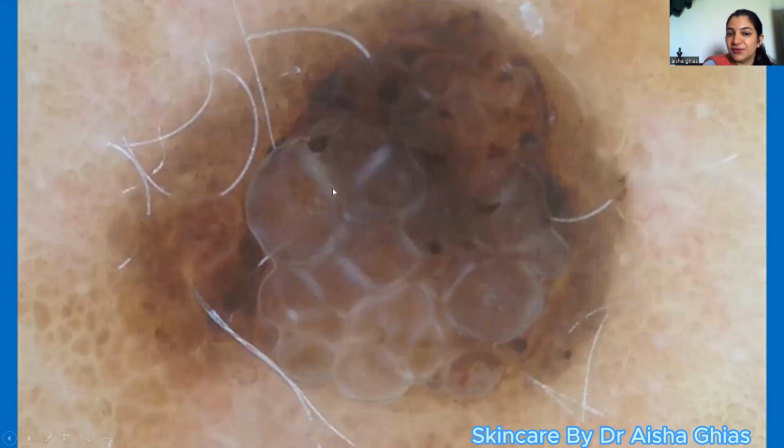And these are only visible with polarized dermoscopy, and they actually sometimes make polygons, like in the bottom of this picture they are making polygons. The different angles and shapes of white lines that enclose some spaces, making the polygonal structures, are called polygons. They may be complete or incomplete, like in the upper part of the picture these are incomplete polygons, so we call them white streaks over here, and we may call these structures which they enclose polygons down there.